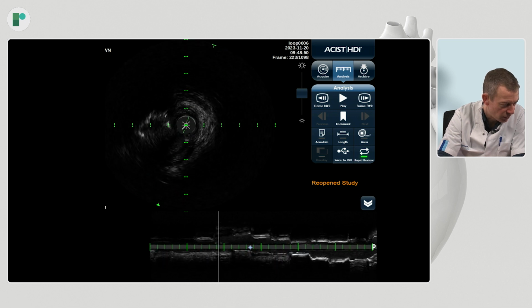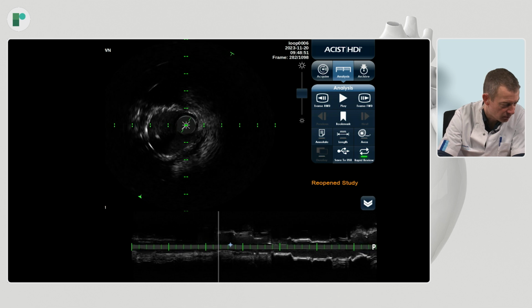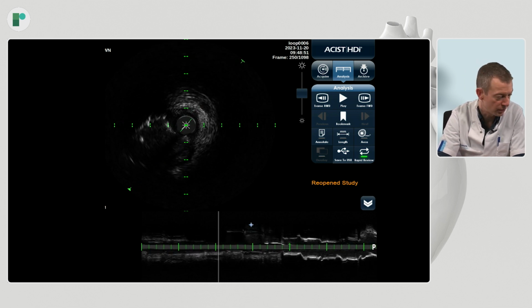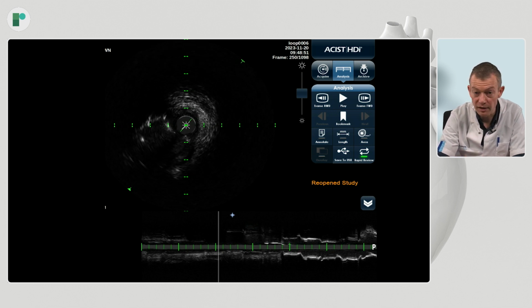Is this a major flaw? Is this a major mistake? I would say this is routine practice. This is what we do in routine practice. We try to take a distal strut, we usually fail, and if we do not fail, we usually don't confirm.